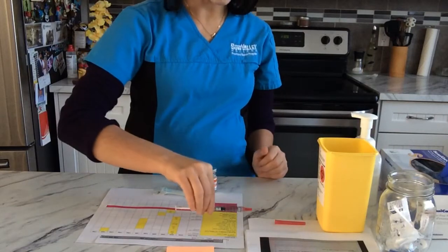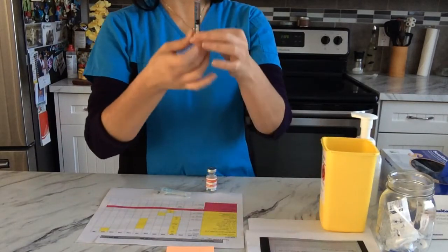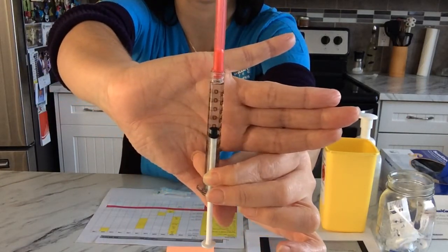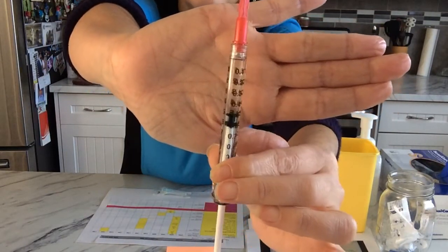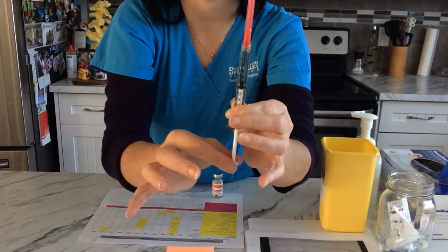I'm gonna do one hand scoop technique. I don't see any bubbles here. And I'm gonna withdraw a little bit to prime my needle, my other needle.